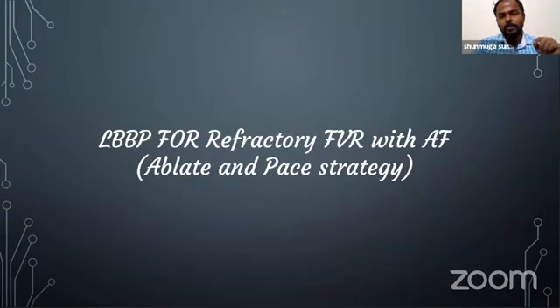The pace and ablate strategy for patients with fast ventricular rate and atrial fibrillation has been there for a long time, but people are not doing it because it is like creating one disease, RV pacing complications, for treating another disease, AF with fast ventricular rate. We ablate the AV node and pace the right ventricle, and pacing the right ventricle produces a lot of complications. So people are not doing it that frequently.